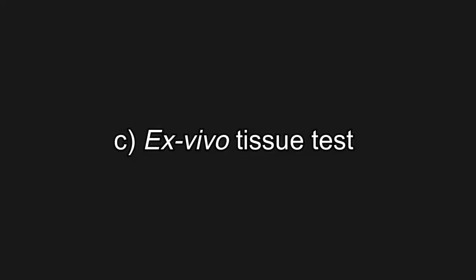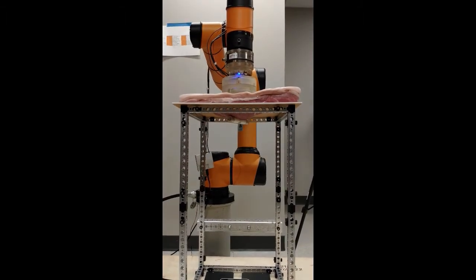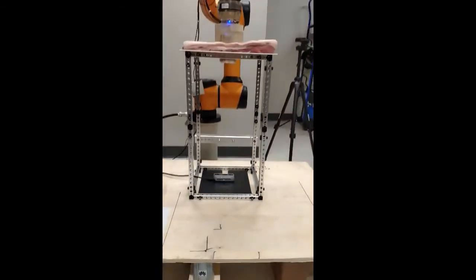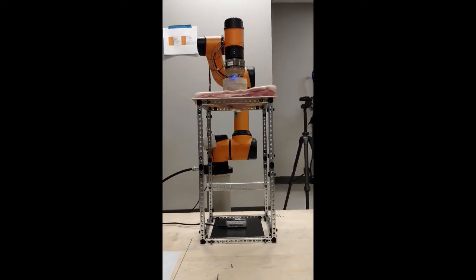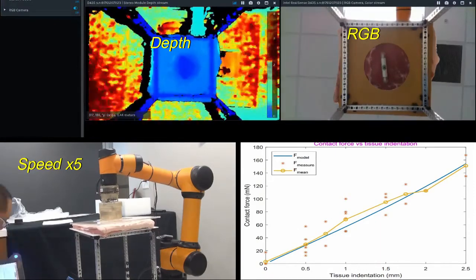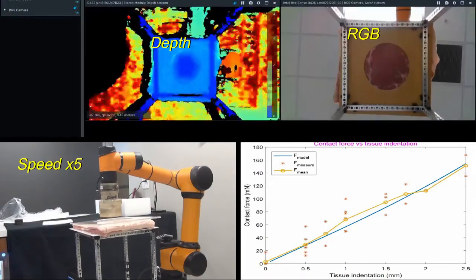More importantly, we verified the model by comparing the simulation results with data collected from experiments on a piece of pork tissue. The experiment was done in an ex vivo setup assisted by a non-invasive camera tissue interaction force measurement approach. Meanwhile, a RealSense Intel 3D depth camera was utilized to measure the tissue indentation. During the experiment, the actuator was moved up at a step length of 1 mm until the camera fell off the tissue. At each step, the contact force and the tissue indentation were recorded.